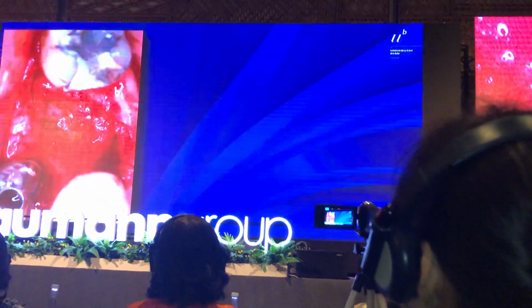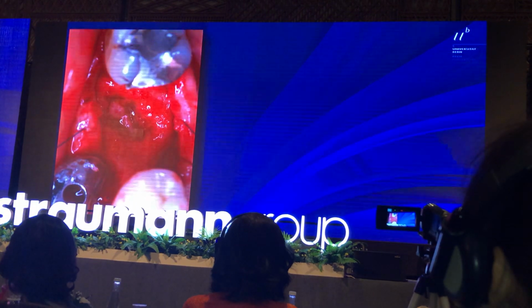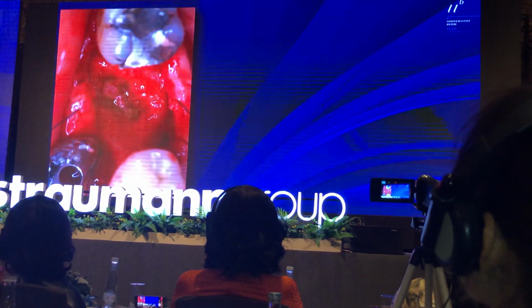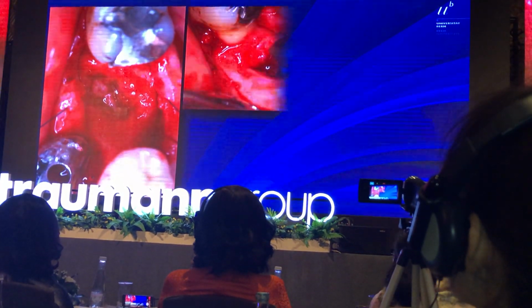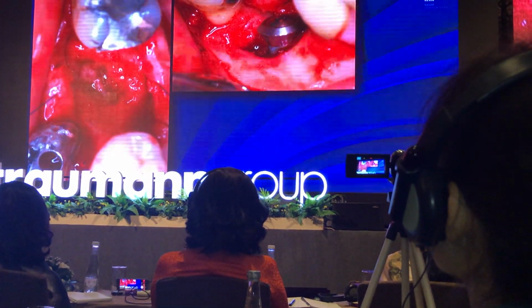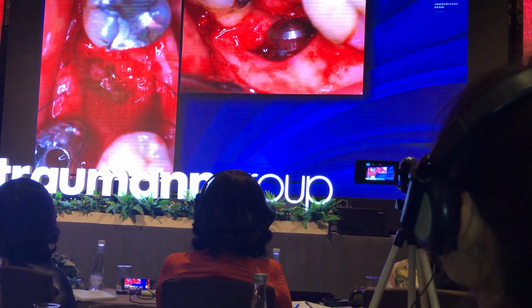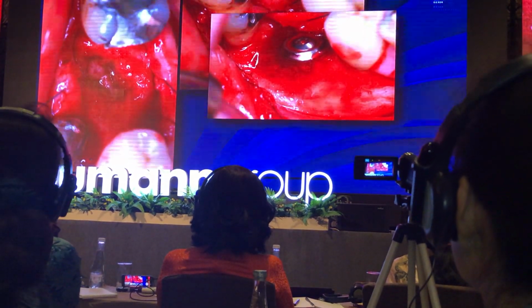Implant bed preparation, and then you clean out the granulation tissue in the defect to see what the defect is. When the defect has an intact buccal plate, then I often use autogenous bone, Bio-Oss, no membrane. I don't spend the patient's money on a membrane, because we overfill it and the buccal wall is intact. That's what we did in this case. So here you see the implant is inserted, and you see the bony wall is fully intact. So it's like a bathtub. So then often I don't use a membrane, I just fill it up. That's what we have done, and you see that here.